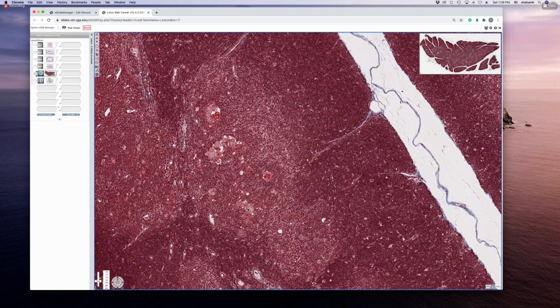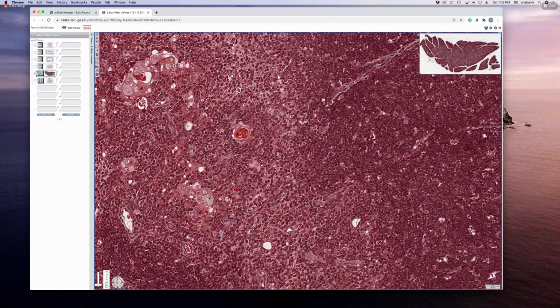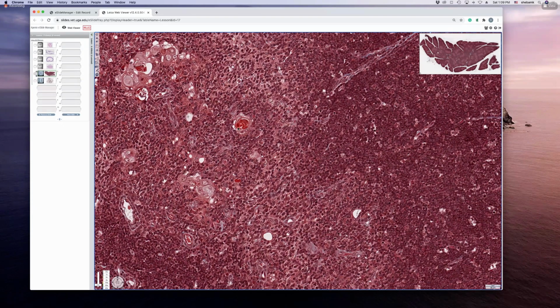That's why they're called epithelial reticular cells. They try to become stratified squamous, produce keratin and all of that. So that's why you see these whorls in the medulla, especially in older animals.